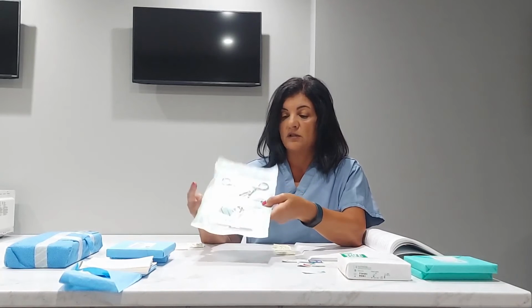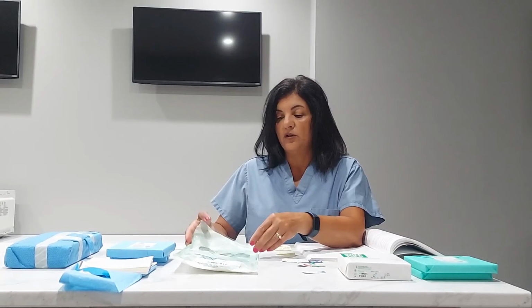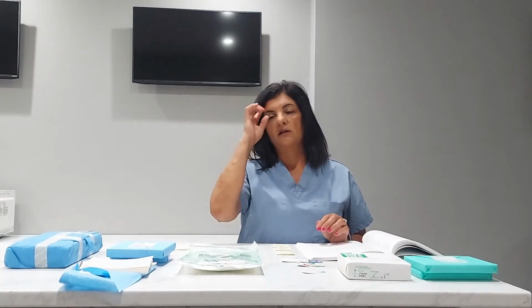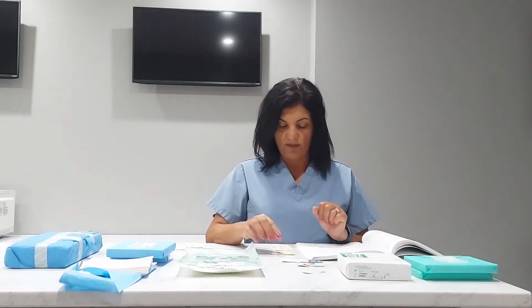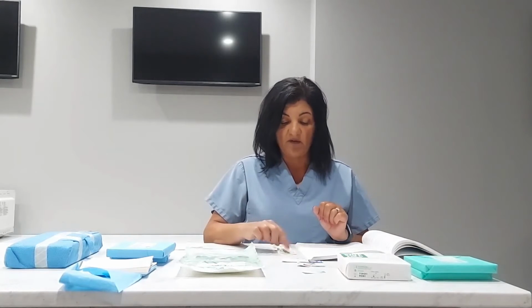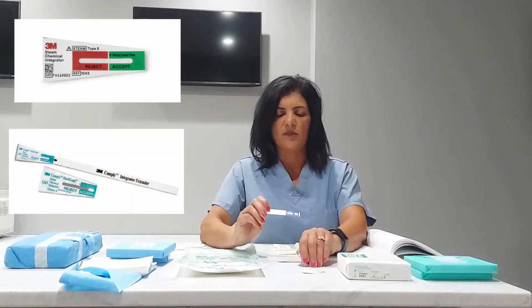And then of course, I do also see a load sticker, and I would of course look at the tape on the sterilizer, and if there was a biological, incubate the biological, and so on. So again, it's a lot of visual indications that sterilization has occurred. So that kind of got ahead of myself, but the type 5 indicator, there's several brands on the market.